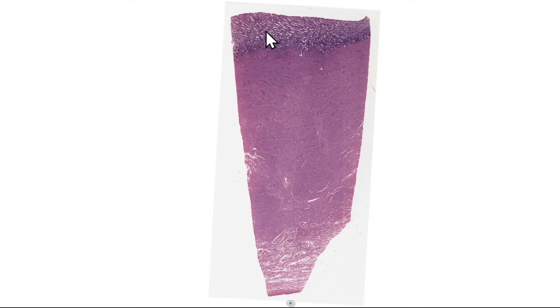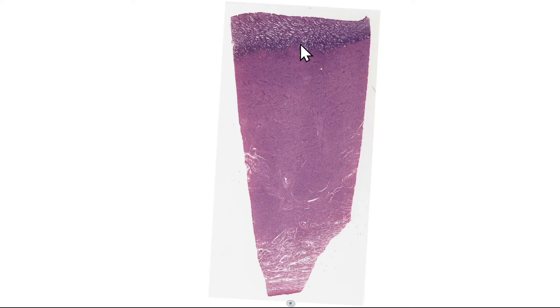So you remember the uterus is divided into 3 layers: the innermost endometrium, then the middle myometrium and the outer perimetrium. Now the endometrium is further subdivided into an outer functional layer known as the stratum functionalis, or just the functional layer, and the stratum basalis or the basal layer, and that's typically much more basophilic — you've got much more compacted stromal cells there.